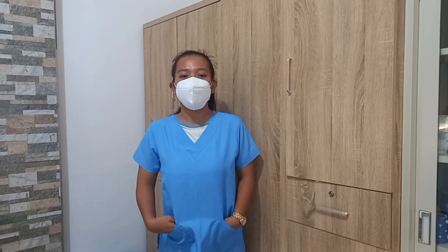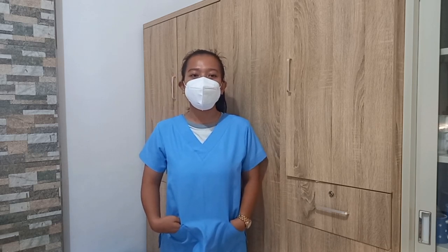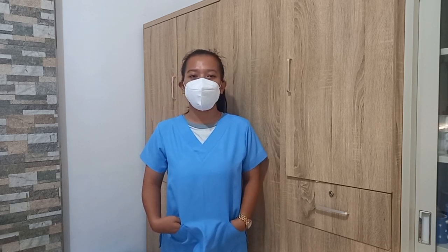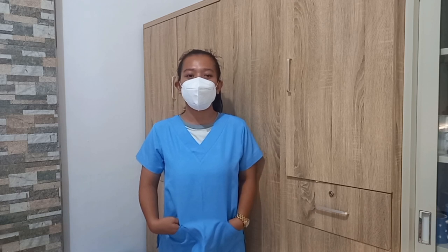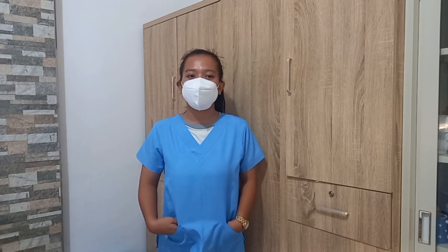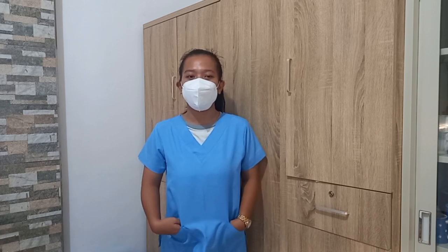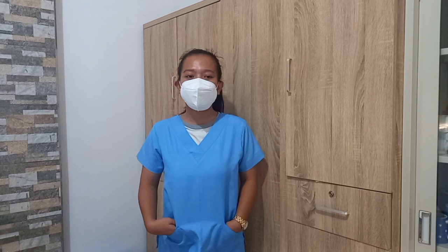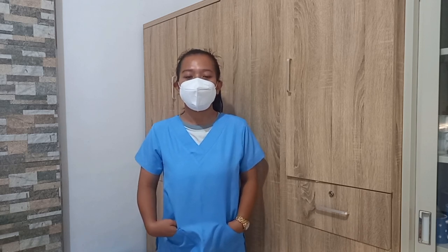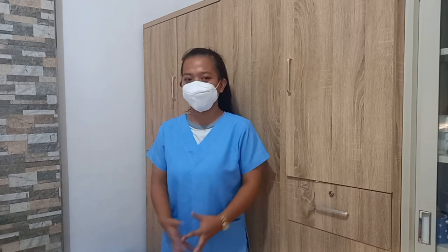Continue with ambulation for the planned distance and time. Return the patient to the bed or chair based on the patient's tolerance and condition, ensuring that the patient is comfortable. Make sure the call bell and other necessary items are within easy reach. Then remove PPE if used, perform hand hygiene, and document. Thank you.